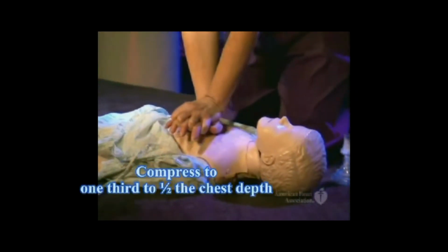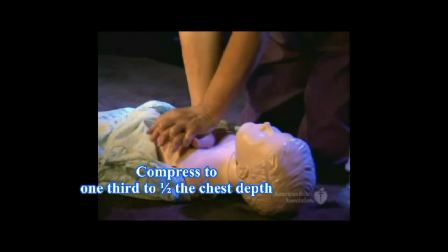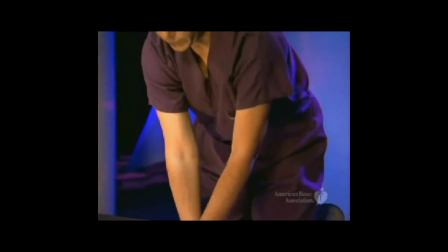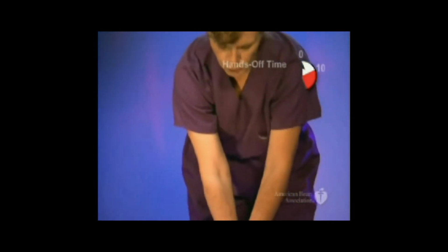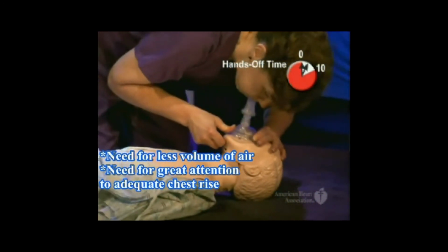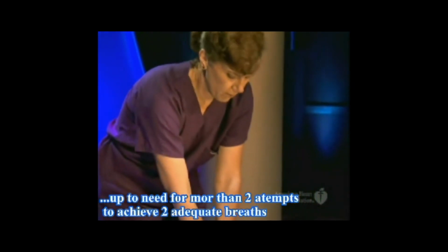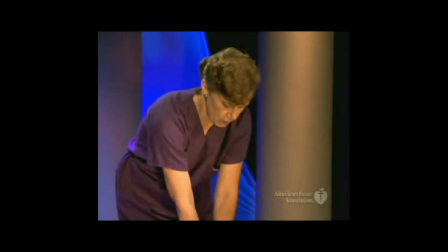One, 2, 3, 4, 5, 6, 7, 8, 9, 10, 11, 12, 13, 14, 15, 16, 17, 18, 19, 20, 21, 22, 23, 24, 25, 26, 27, 28, 29, 30.